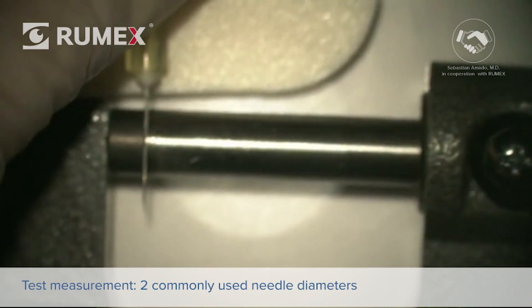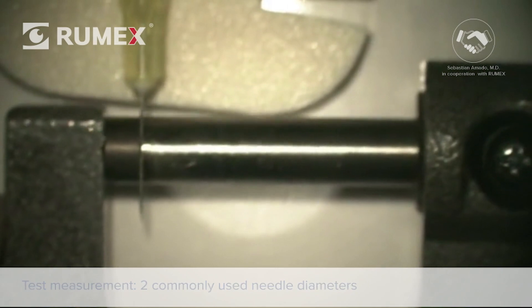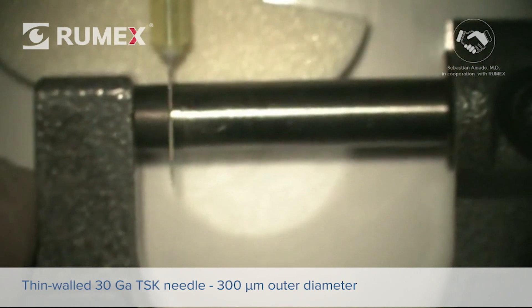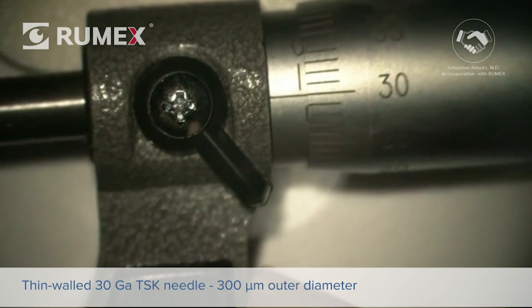Furthermore, we performed some measurements of the diameter of two commonly used needles for the Yamani technique. We tested first the most suitable thin-walled 30-gauge TSK needle, which resulted in a 300-micron outer diameter.